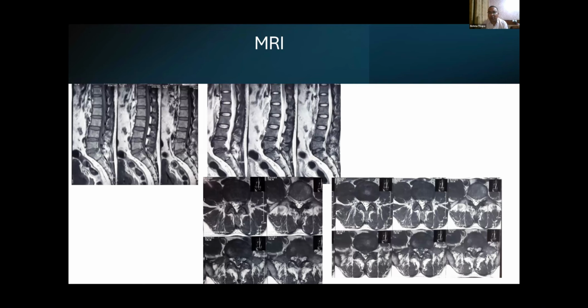That is one of the intraoperative things. And preoperative assessment is also mandatory. Like in this case, I removed two fragments first. One fragment was very large, but again I rechecked the inside and was still in doubt. There was still a large fragment there, so I removed the large fragment at the end.